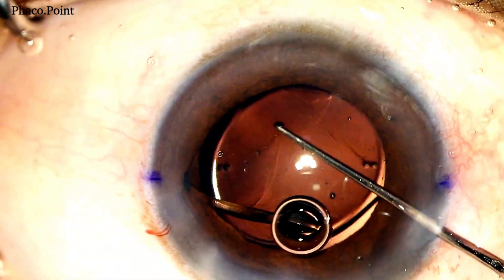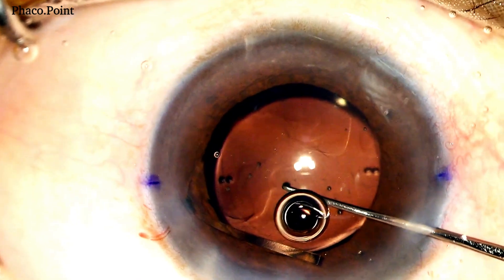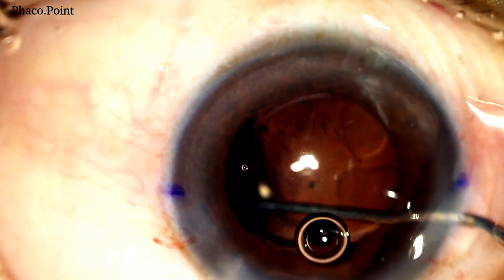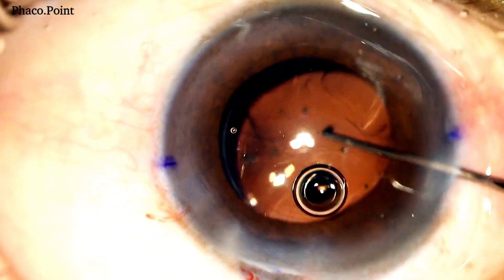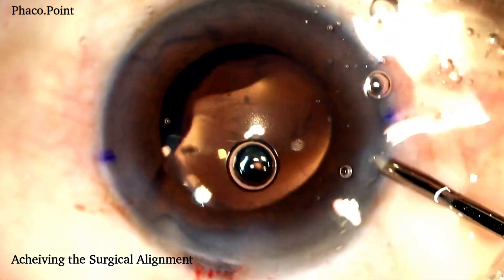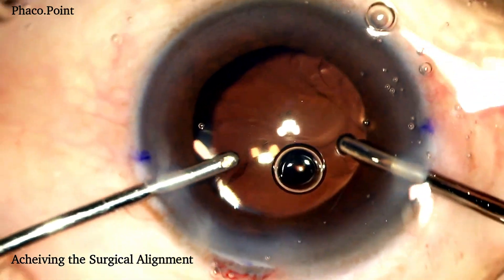With the help of a Sinski hook, I now rotate the IOL to a point where the dots on the IOL ideally could be just short of the corresponding points on the cornea, and gently push on the optic backwards to enable the trailing haptic to enter into the capsular bag. The IOL implantation within the capsular bag is now quite standard. The challenge now is to obtain a perfect alignment of the dots on the IOL to correspondingly match with the dots on the cornea.